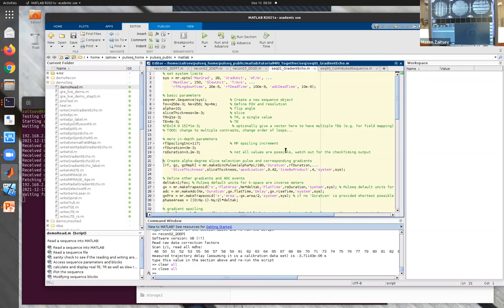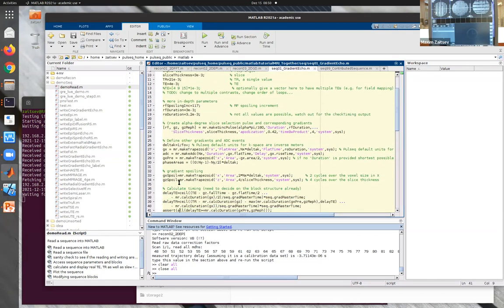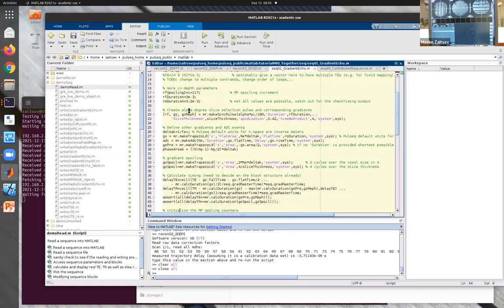But at this point, we will first try to generate our sequence and basically generate your RF pulse. And the nice thing about the makeSincPulse function is that it can actually generate the gradients too, and with that you already have your slice-selective excitation defined.